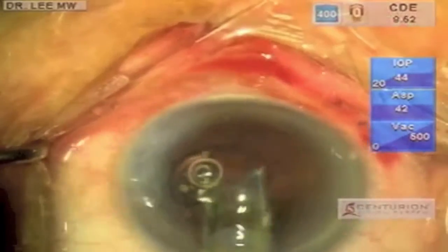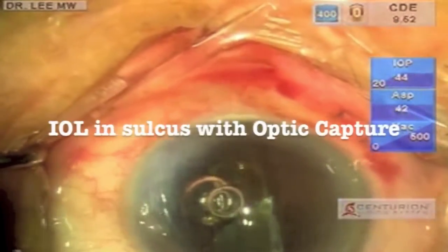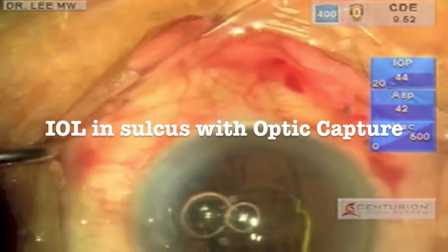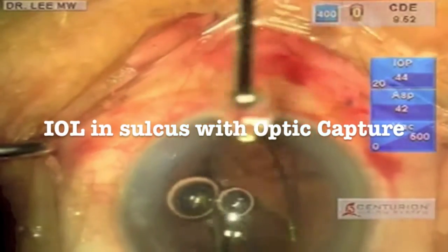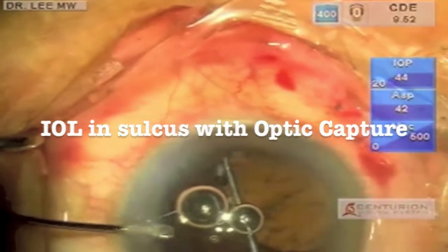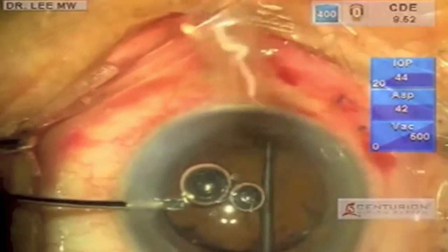If the anterior capsule is still intact, oftentimes we would insert a 3-piece intraocular lens into the sulcus and subsequently prolapse the optic beneath the anterior capsule to perform an optic capture. This technique allows good centration and stabilization of the intraocular lens.